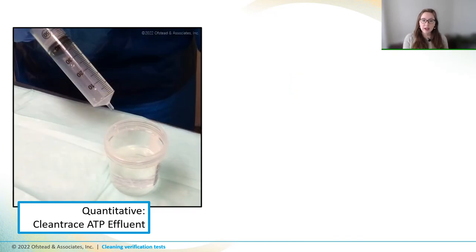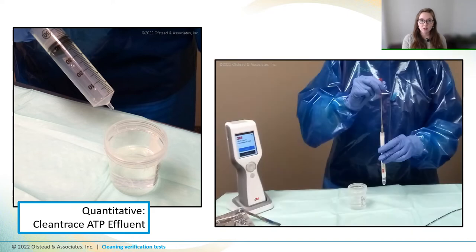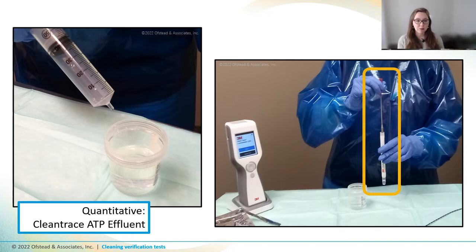You can also do ATP tests of effluent by flushing the channel with sterile water and then dunking that little wand in the sample before placing it in the luminometer for analysis. Now this wand has little ridges on the end that get filled with effluent, so it's important to hold the wand straight up and down so that none of those droplets fall off when you're inserting it into that sleeve.